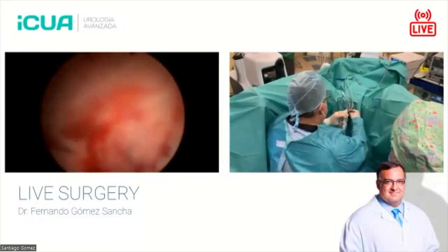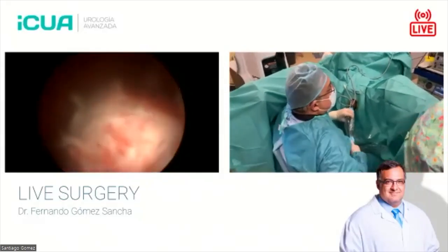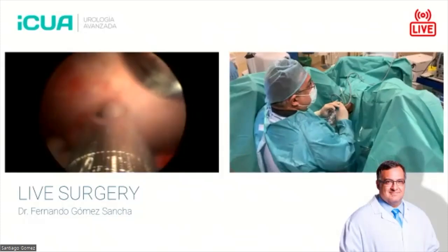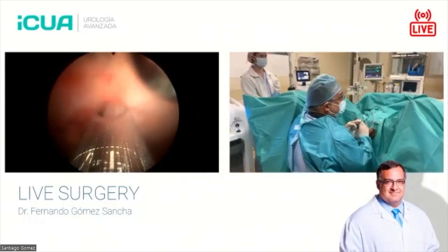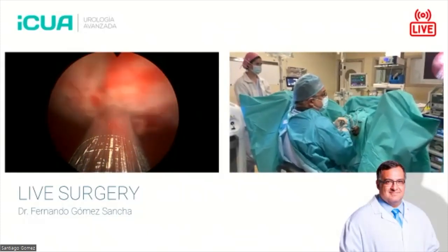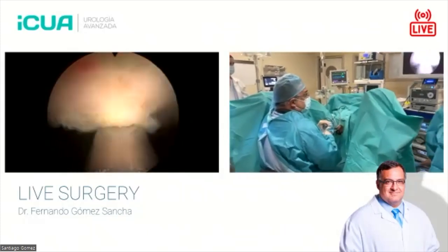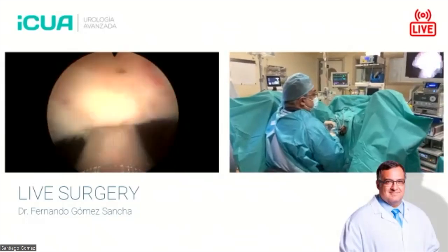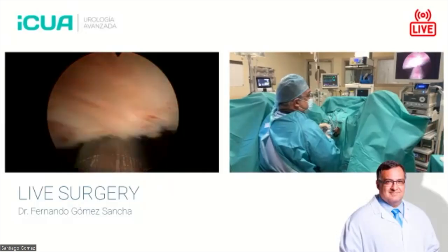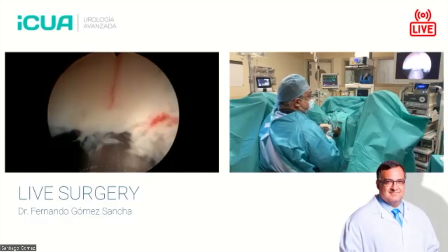So, of course, Felipe has this concept that if you use a smaller instrument, you have probably less risk of strictures, which is a nice concept, which is not proven still. No, there's no evidence apart from his personal experience. But it would make sense for the majority of us that if you use a lower caliber scope, especially if you find a stricture urethra, it makes sense that the risk might be less. Of course, we see sometimes membranous urethral strictures that are very soft.